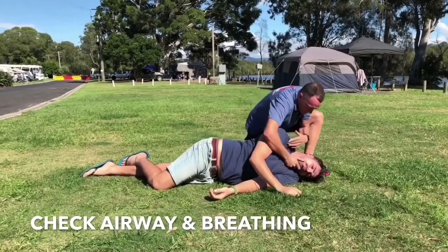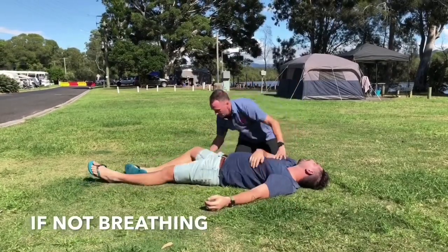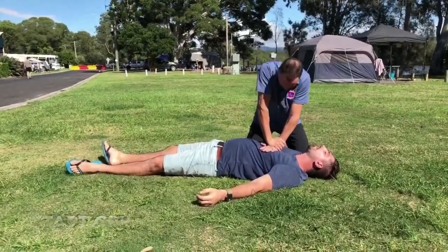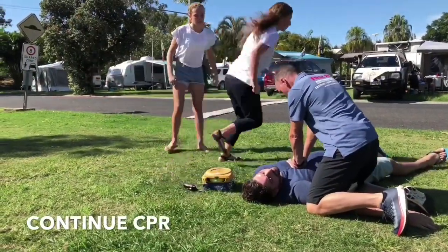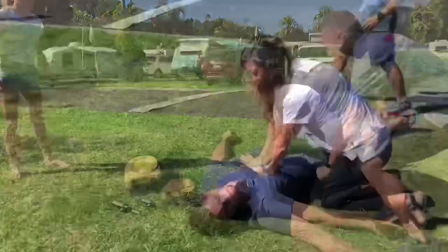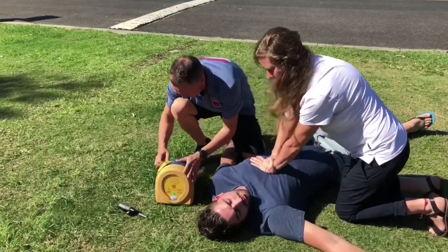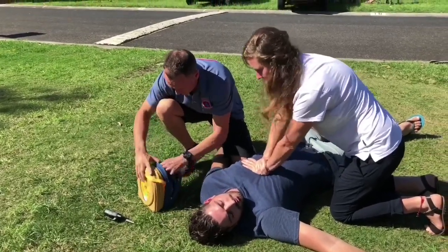It's important at this point in time to check airway and breathing. If there is no breathing, roll the patient onto their back and start performing CPR until the defibrillator turns up. We're doing compressions-only CPR directly on the centre of the sternum, roughly between the nipples, at a rate of 100 to 120 a minute. It's important that we continue CPR while the defibrillator is being applied to the patient's chest.